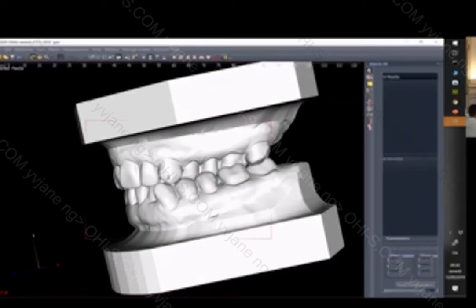And in some models, not this one here, that was a rather old one, but in the most recent models, we have the possibility of having separate teeth for each tooth, and this will lead us to the possibility of making a real setup. So I really love to use digital models nowadays.